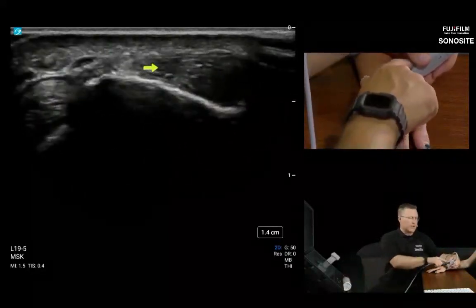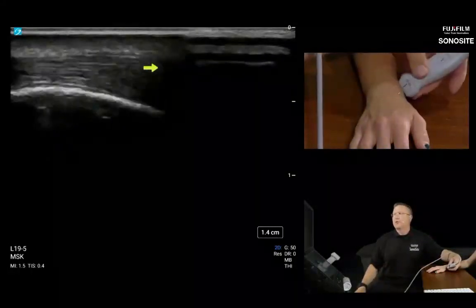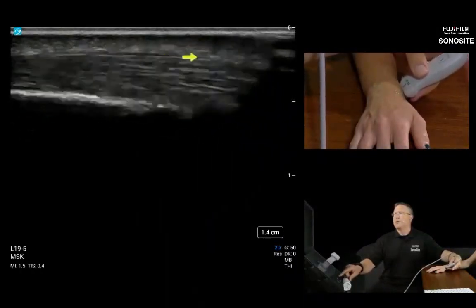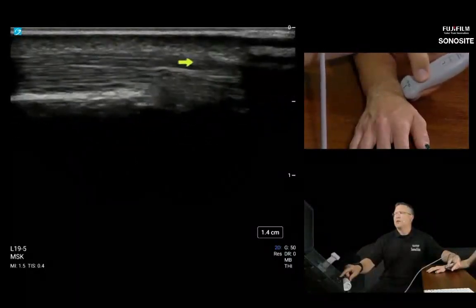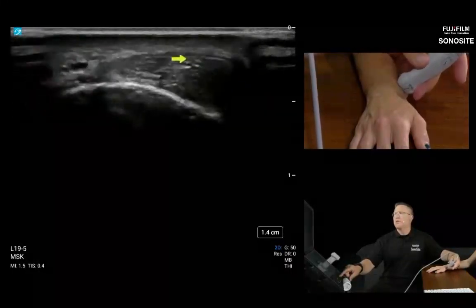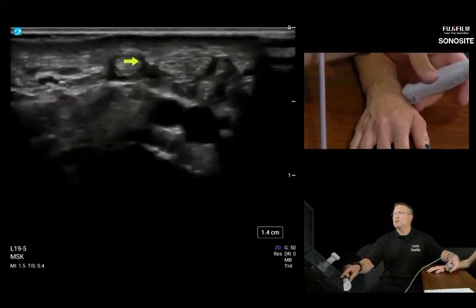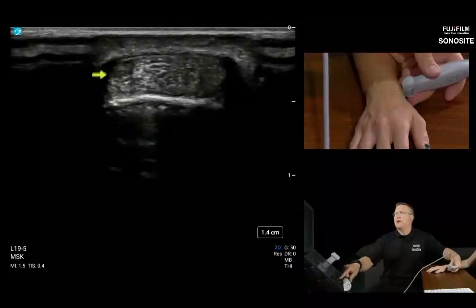So the thumb orientation marker side of the probe will go proximal this time, and I'm just going to elongate these tendon fibers. It's pretty important to denote where the extensor retinaculum is for each compartment so that you know where to look for swelling. Within the compartments, we'll go back to short axis, where we see retinaculum, you won't see a lot of effusion in these areas. You usually see the effusion proximal or distal to the retinaculum, but there's not a lot of room within the shadow of the retinaculum that you see here.